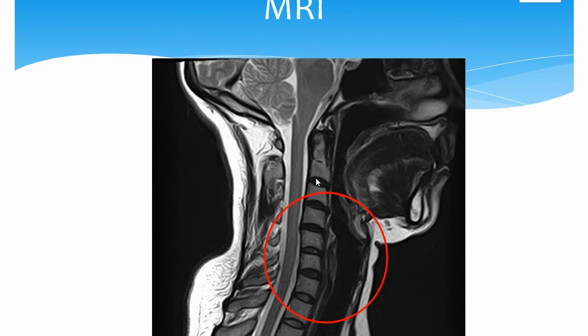But as you notice, the cervical spine is not normal, and it is straight, there is a forward bending at this point, and at the same time you will see that we have disc protrusion at different segments, not only anteriorly but also posteriorly detected in the case.